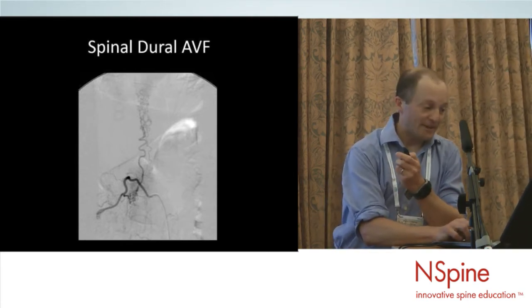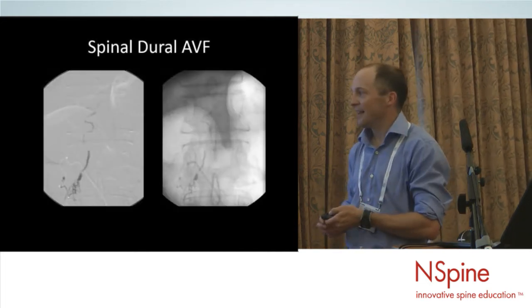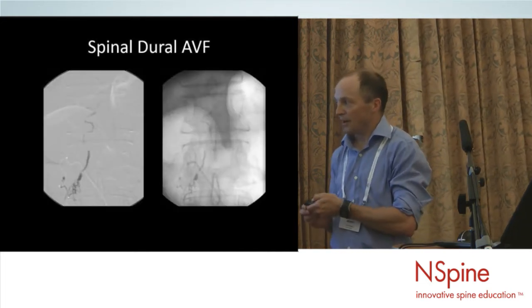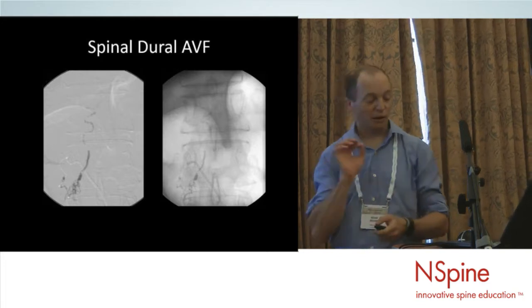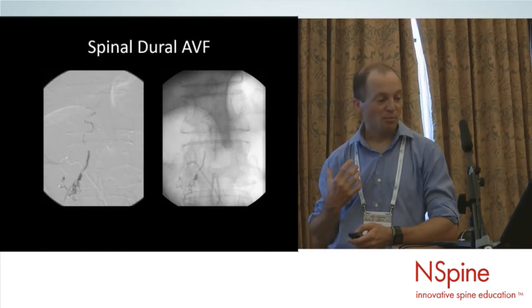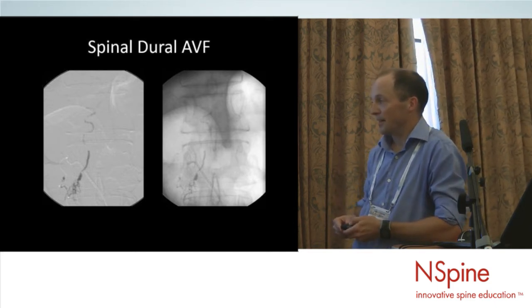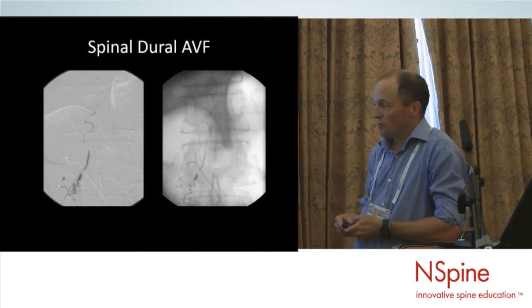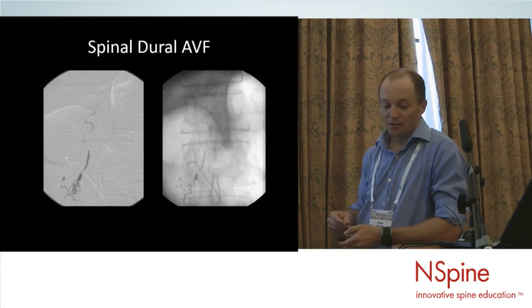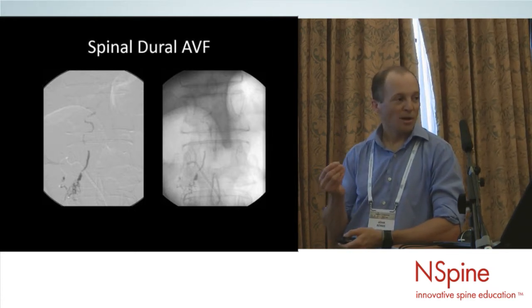And so from an endovascular point of view, and I'm going to confine my talk mainly to endovascular things, the goal of treatment is to get a microcatheter as close as possible to the abnormality, and inject glue would be my preference, although some operators do use Onyx, and I'll come to that maybe in the coming slides. But of course there's a limit to the technology here. You very rarely get all the way to the fistula.